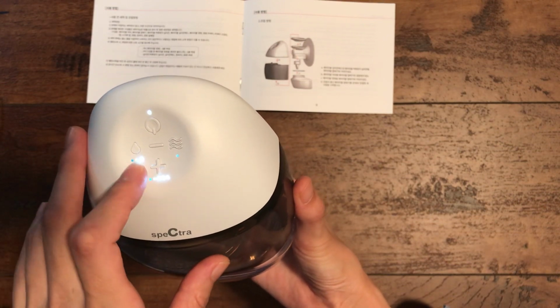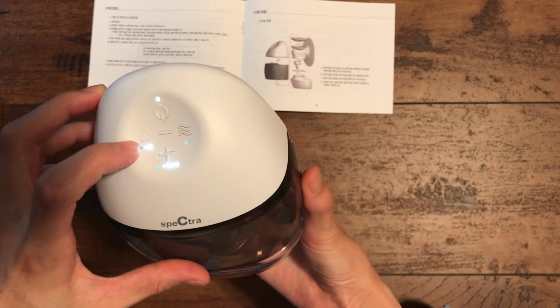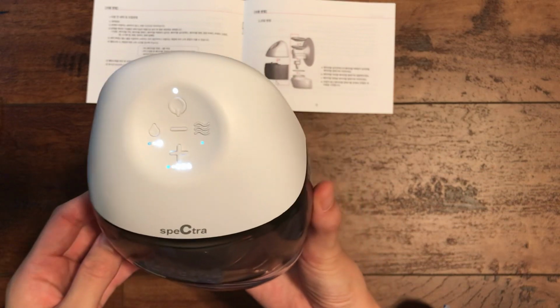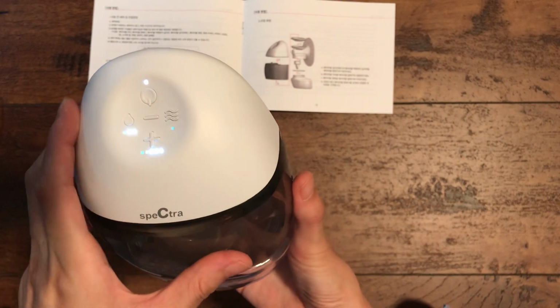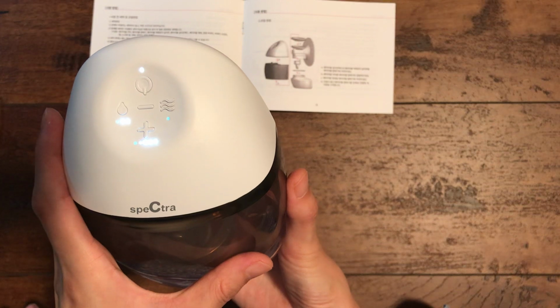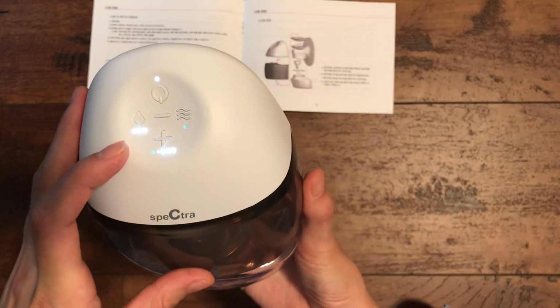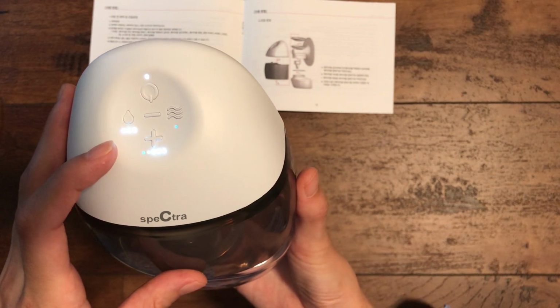With the expression mode, you can increase or decrease intensity too. And then you can change the mode. There are 3 different modes of expression. If you can hear the sound, it's a very steady, consistent clicking noise. And then the second mode is a little different sound. I feel like it starts with a weak intensity, and then there's a little bit stronger. And then the third mode, that's what it sounds like.